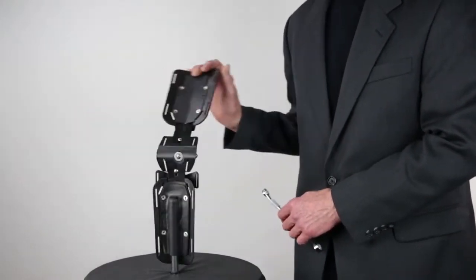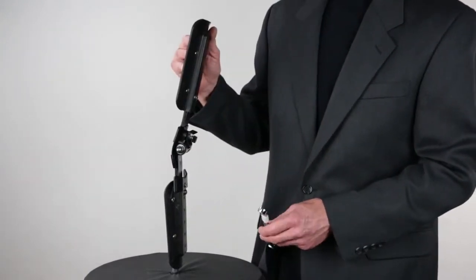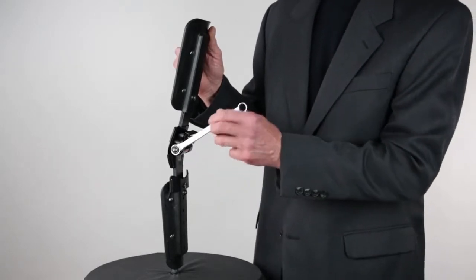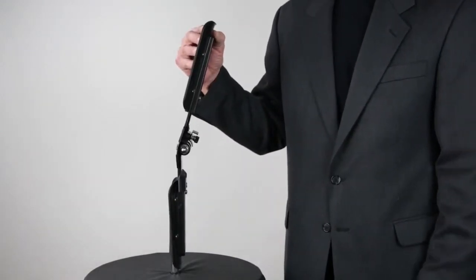From the free motion position, or with the flexion stop adjustment already set, the extension stop adjustment can be set by extending the joint to the required degree corresponding to the red range of motion indicator. With the enclosed wrench, turn the chrome nut on the left side of the brace clockwise until tightened.